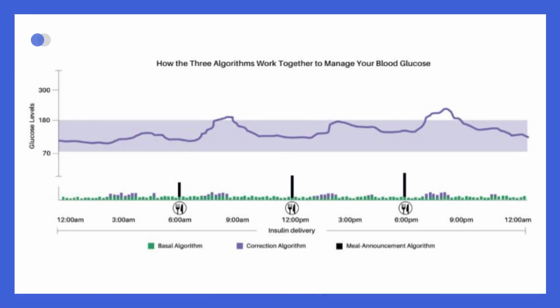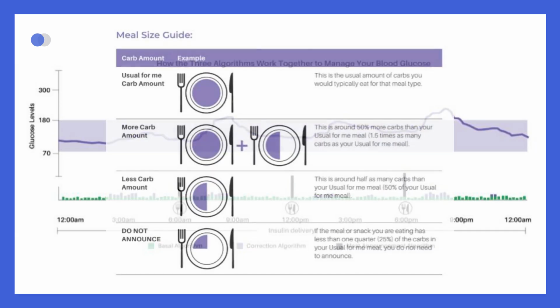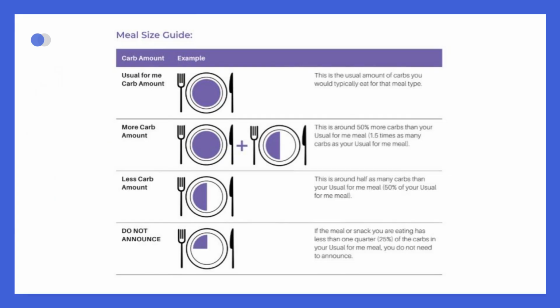The system adapts its insulin dosing aggressiveness based on glucose levels and trends. Basal and bolus dosing adapt continuously, while meal doses adapt separately for breakfast, lunch, and dinner. Meal doses are adjusted over time based on the 4-hour postprandial bolus insulin needs of past meal announcements. They aim to provide 75% of required insulin for a meal. Any additional insulin needed for the meal will be provided by the corrections controller.